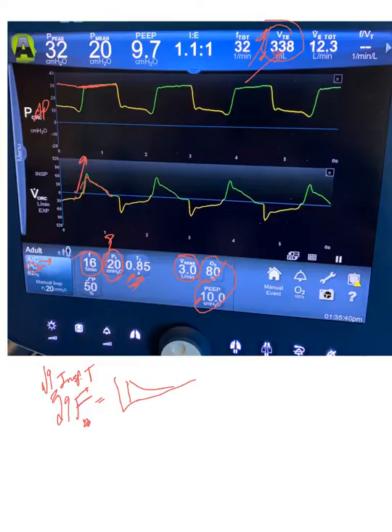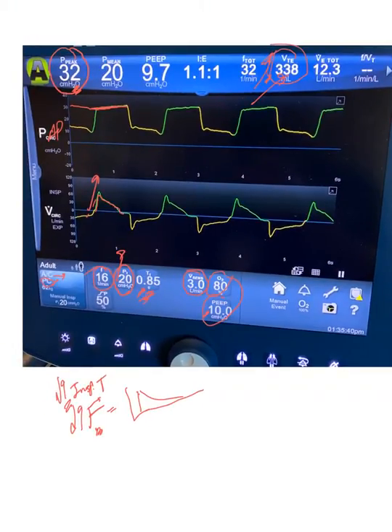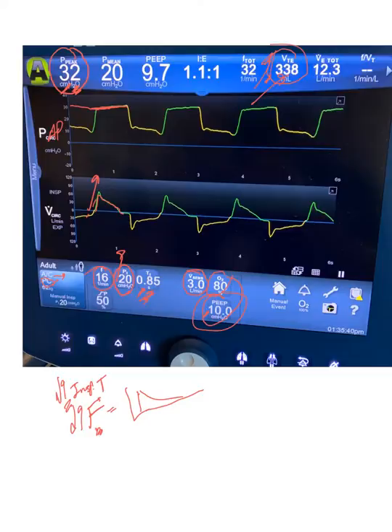I want to quickly introduce something we'll discuss later: the peak value, which is the highest proximal airway pressure during inspiration. As you can see, it's equivalent to 20 plus 10 PEEP, which equals 30 — give or take a 2 or 3 margin. That is the maximum proximal airway pressure during inspiration that the ventilator displays, and in pressure control we decide our settings based on this number.